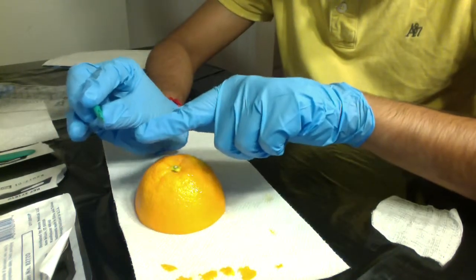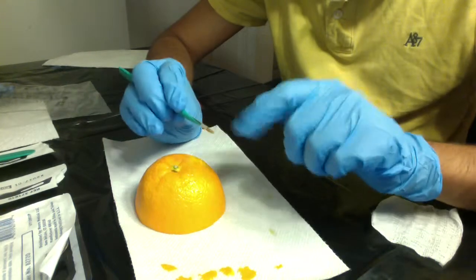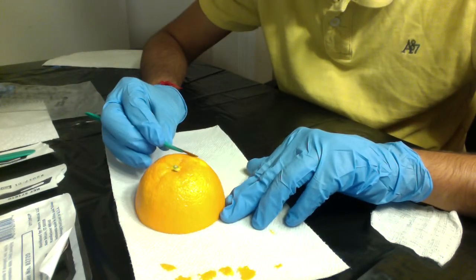I'm also using just the curved part of the scalpel, not using the tip of the scalpel.